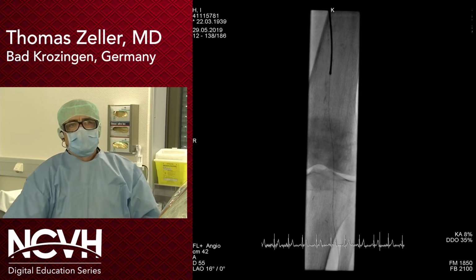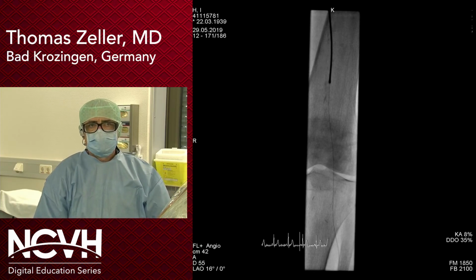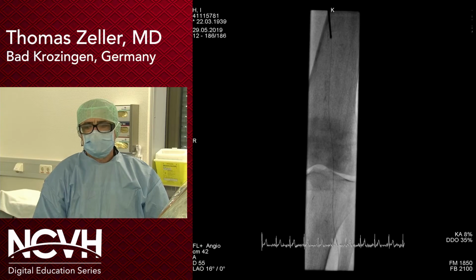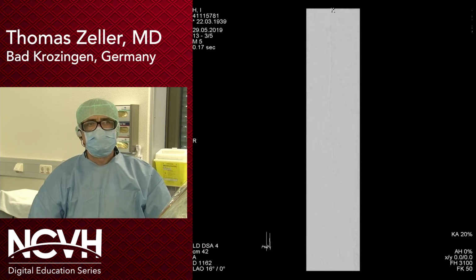So, any questions? Dr. Zeller, up to this state of the procedure, if you had gone subintimal approximately there, which is obviously a very significant risk of that, would you have considered a retrograde option? Yes, of course.